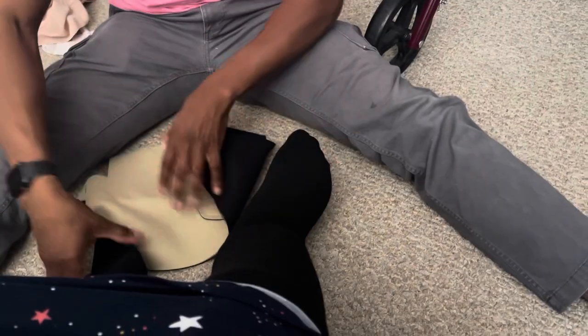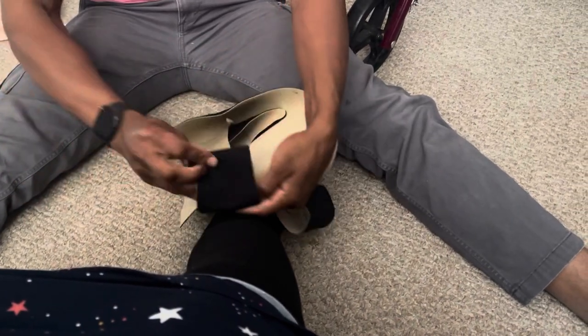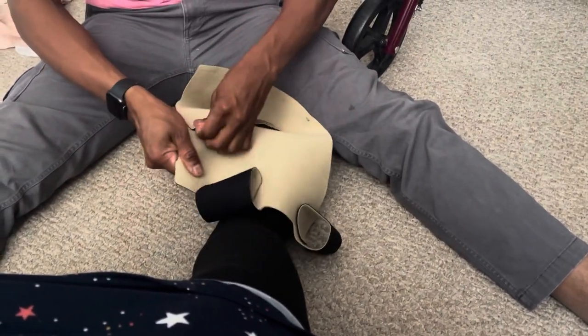After the sock is applied, you're going to apply the compression garment section. For this section, you're going to want to make sure that you roll the Velcro straps back so that they don't get in the way as you're applying the garment. Roll each strap back.